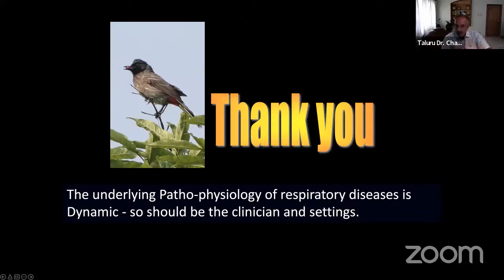So the tidal volume and the respiratory rate alter in such a way that it is always in that square. For example, in a COPD patient, the area will be more on volume alteration and less on rate. The rate goes within a very, very small range, whereas volume changes will be more. Whereas in ARDS, the rate is more altered and the volume is maintained less.